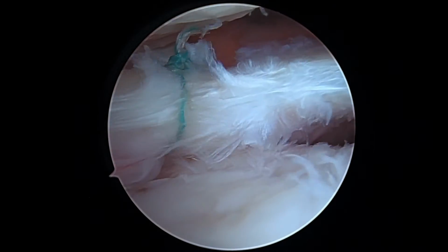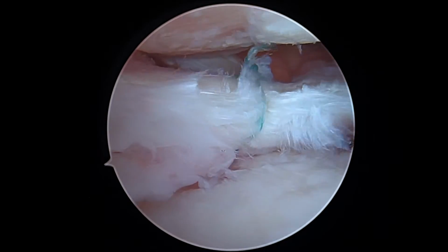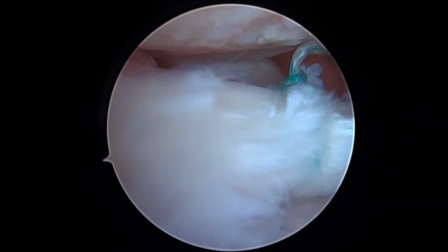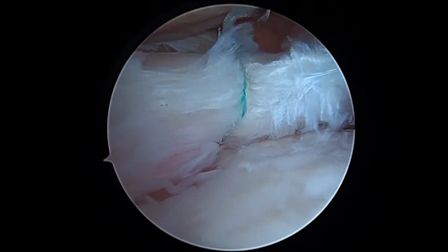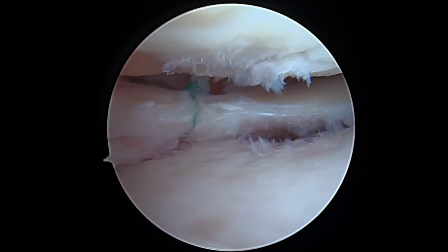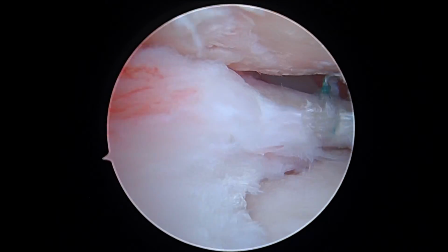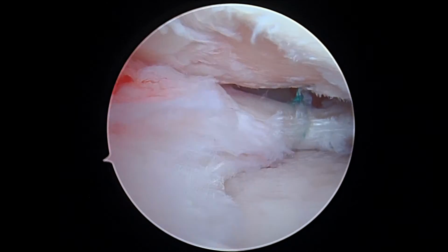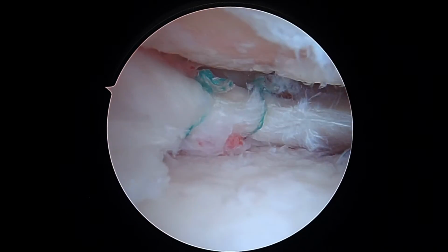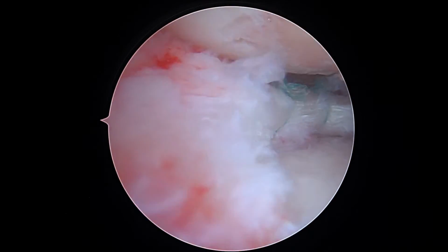Okay, so here's the first stitch. See, we've got that meniscus repaired right at the popliteal hiatus. That's the popliteus tendon back behind. So we did what we call kind of a hay bale technique, where that suture goes all the way around the meniscus to hold it together. And now we're going to place one more a little bit to the left, which is a little more anterior. Okay, so we've got our second stitch around. You can see how we're now holding that meniscus together.